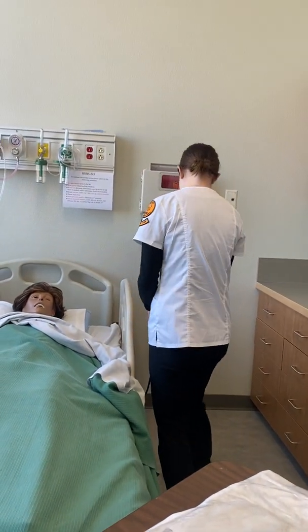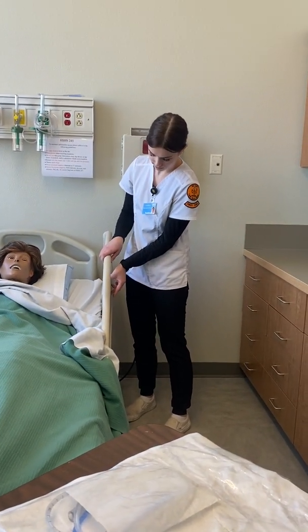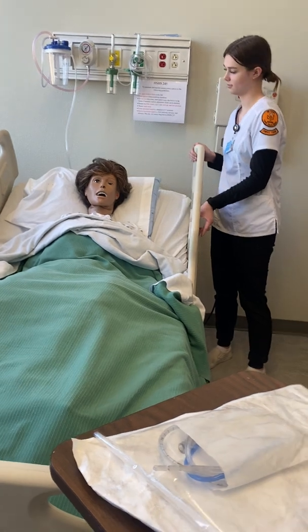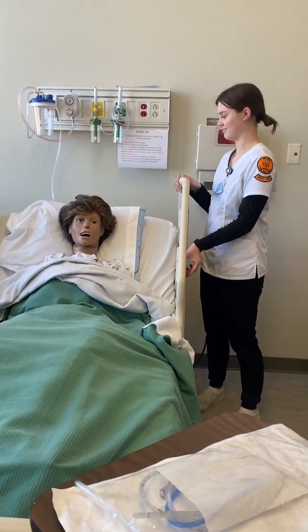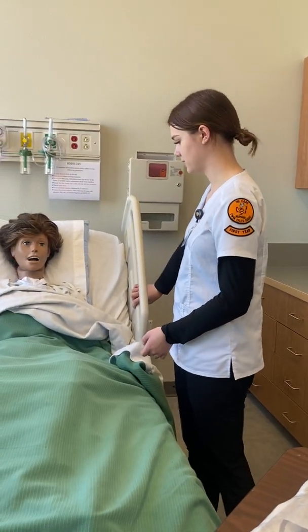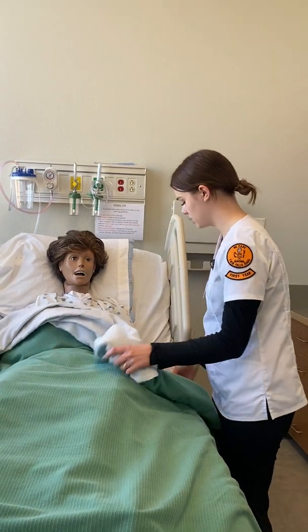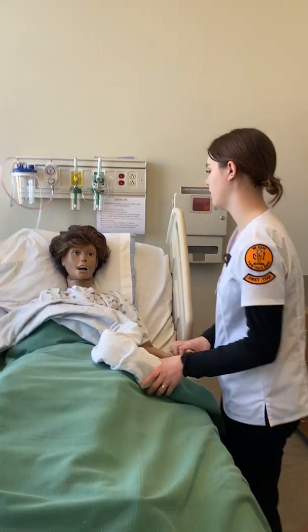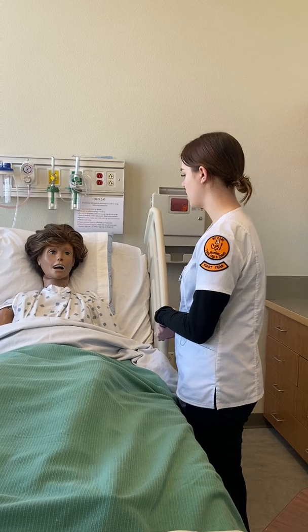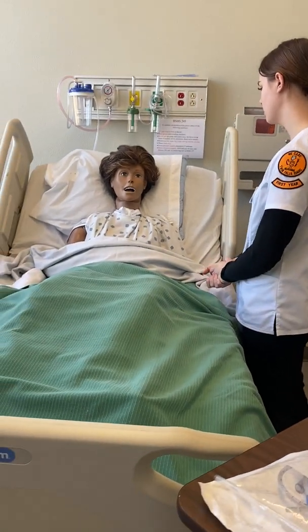All right. So I'm going to go ahead and sit the head of your bed up, if that's okay with you. All right, feeling comfortable? I'm just going to go ahead and raise your bed up to a good height. I'm going to put this pulse oximeter on your finger. We're just going to keep that on throughout the procedure. And then I did want to ask, do you have any history of a deviated septum, breaking your nose, surgeries, things like that? No? None?